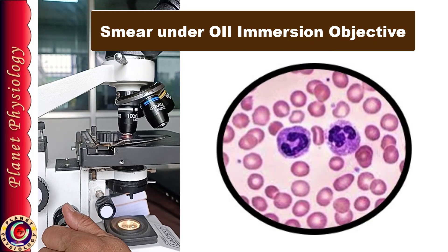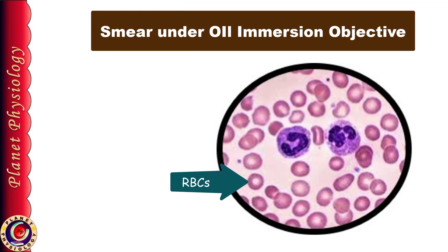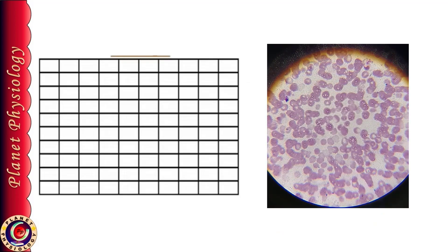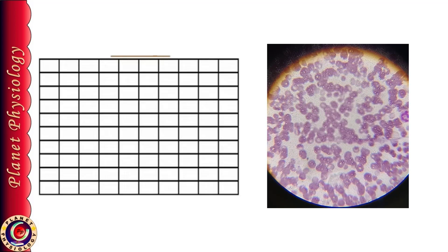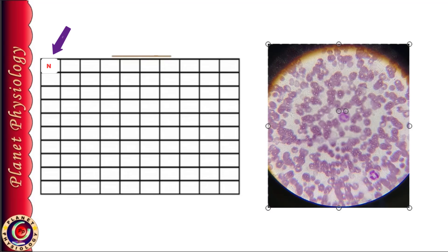This is how you will see the cells now. Majority of the cells you visualize are RBCs, and there may be few stained WBCs amongst them. Sometimes there may not be any WBC in the entire field — don't worry. Move the slide slowly towards the tail end while looking for any stained cells. As soon as you come across a stained cell, stop moving. Identify this WBC and note it down by its initial alphabet in your observation table. Before starting to count, keep a 10×10 grid ready in your notes. Alternatively, if you have a cell counter, you can just hit the counter button indicating that particular cell.